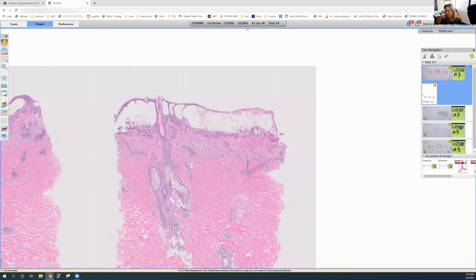And today is going to be unknowns, covering in part the last few chapters of Lever that my colleagues covered this last month: viruses, protozoa, and the histiocytoses. Since we didn't have a large number of cases in our study set for those three chapters, I'm going to go over a few unknowns, and then I'm going to show you some interesting cases from my last couple weeks of practice. So let's dive right in here.